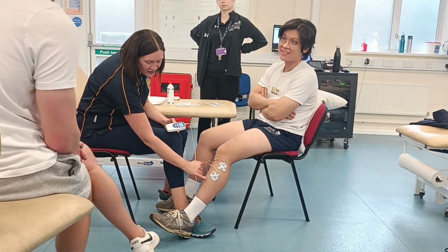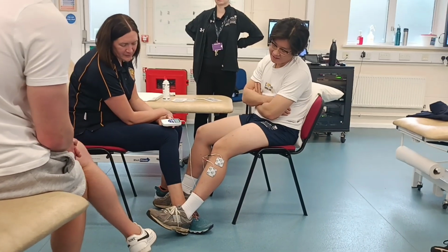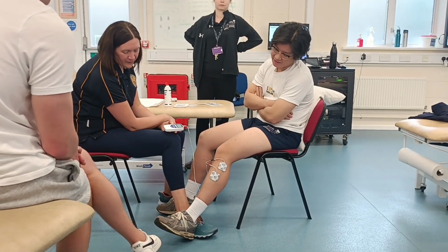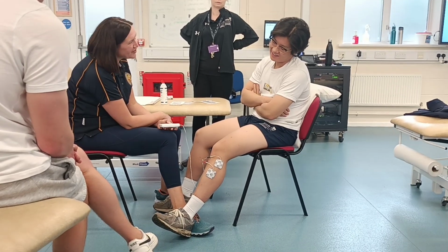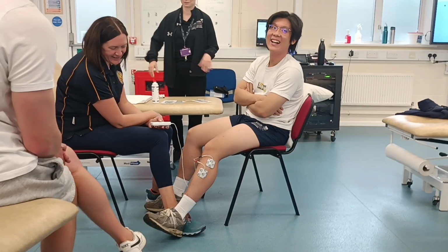Yeah. I'm going to do one more. Give me 1 second. Get a bit more dorsiflexion. There you go. Tiny bit more dorsiflexion. Yeah, not uncomfortable. You're still smiling. Yeah. Not grimacing, really smiling. Nice.